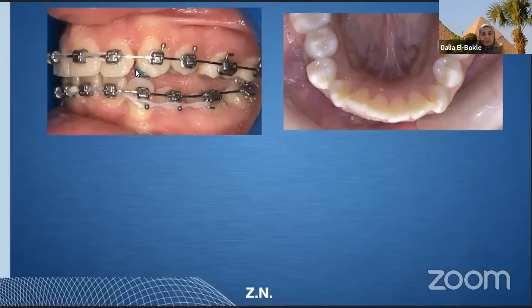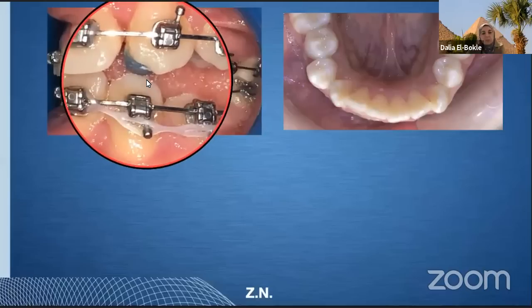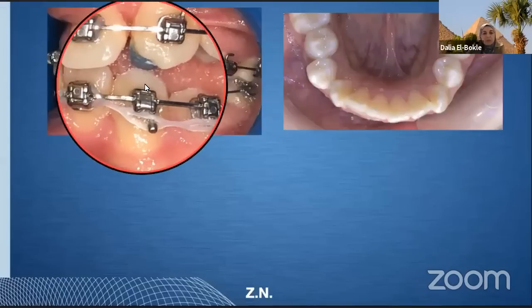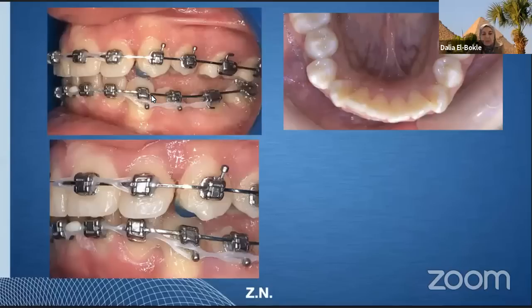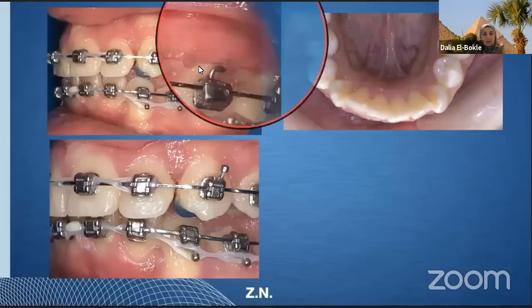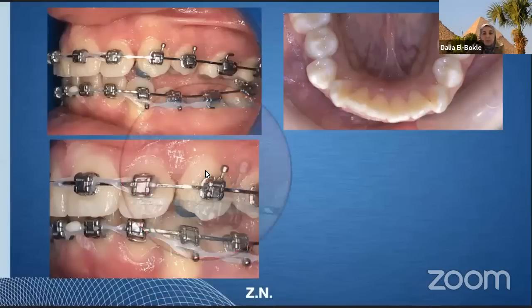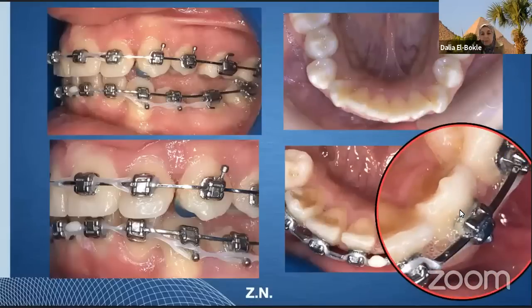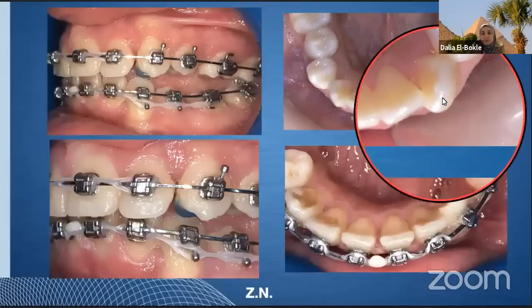What happened was that the lower cuspid moved lingually to the bite turbo. That's why, you remember, in the beginning of the presentation I told you to try to make the turbo as long as possible on the cuspid so that the patient cannot slide the jaw sideways. So this is how she looked the following visit, how the lower cuspid moved lingual to the turbo on the upper cuspid. And you can appreciate here the lingual positioning of the canine, whereas it was never lingual to start with.